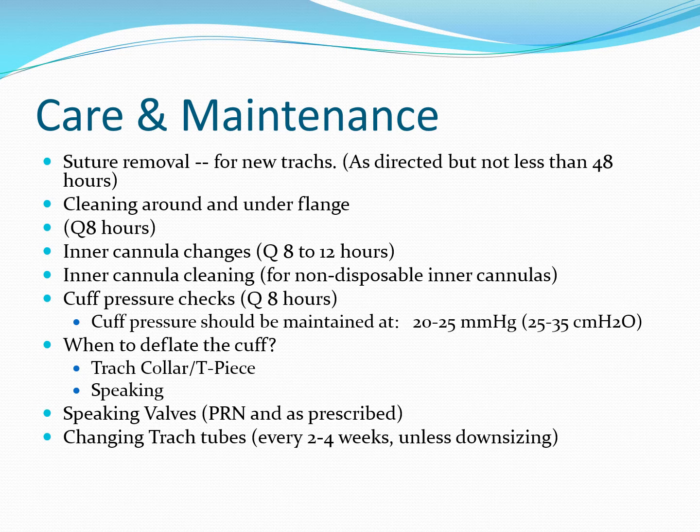For individuals that have had, let's say, a neck resection because of a malignancy or other condition, we typically will keep the cuff inflated despite the patient being spontaneously breathing for the first day or so after the surgery, to help reduce the amount of drainage that goes down into the airway and potentially into the lungs. But by and large, for spontaneous breathers who have trach tubes that are cuffed, the cuff should be deflated.